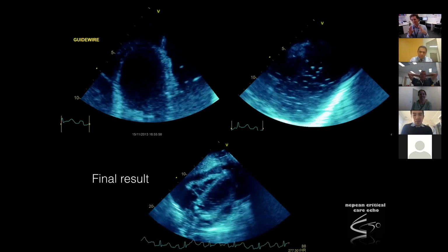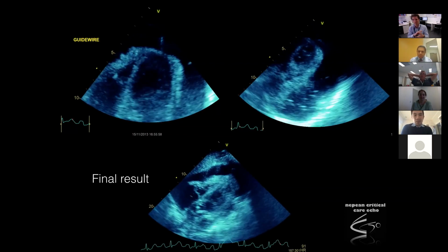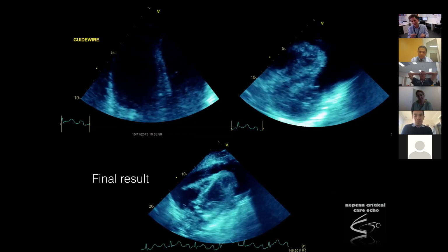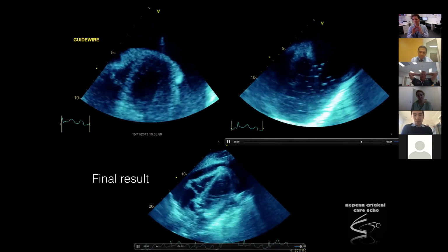I generally find the best thing to do is literally take out a couple of mils of the pericardial effusion and squirt it straight back in. You don't have to mess around with any kind of agitated saline. Just the physical action of squirting pericardial effusion back into a space makes the bubbles look like this, and it lights up like a Christmas tree.